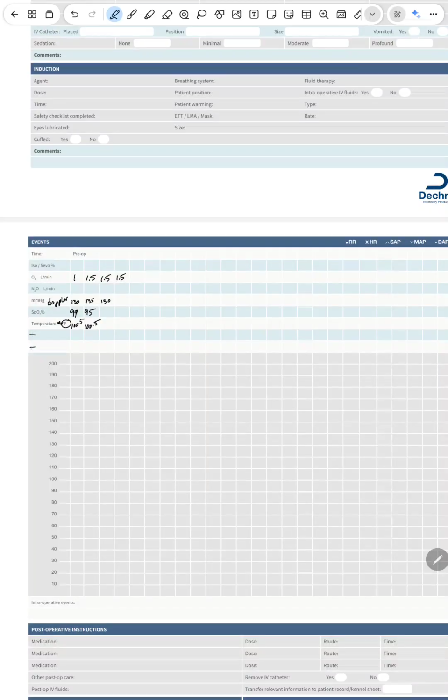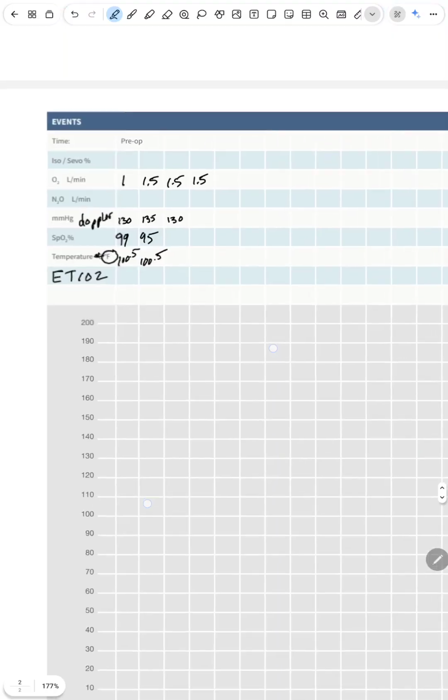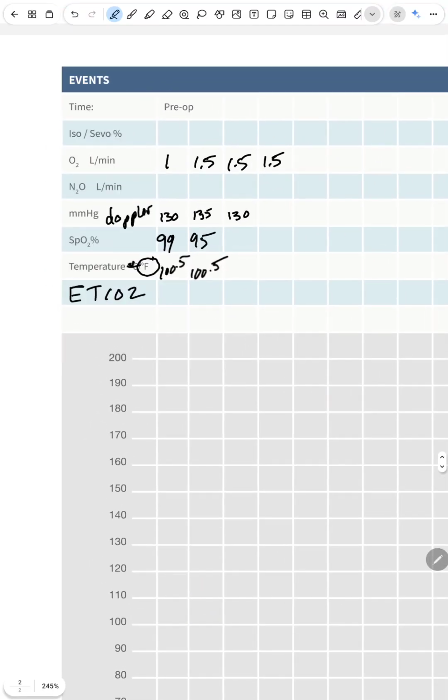And then they've got a couple of blank lines for you to add things. And so I'm going to say, well, gosh, that's nice, but what do I need to add? Well, if we look at our key or legend, that doesn't have any end tidal in it, and this chunk doesn't have any end tidal in it. Therefore, I would like this to be end tidal CO2, and I'll have that in there. Or what I should really do, because look at how specific they got. SpO2 with a percent next to it, right?